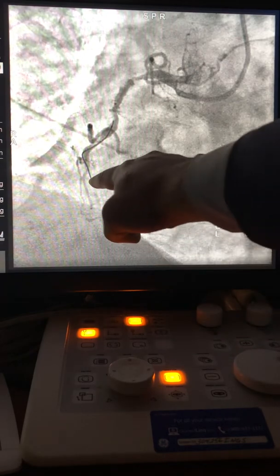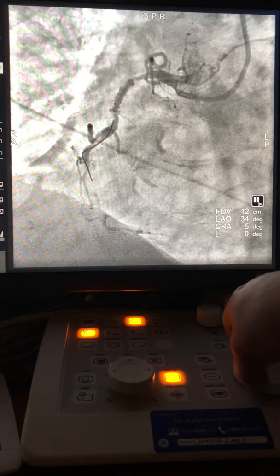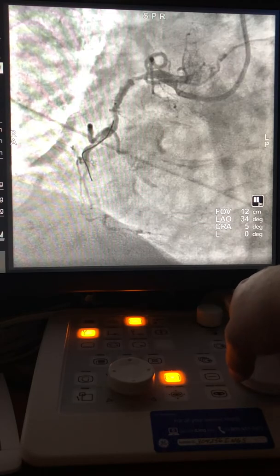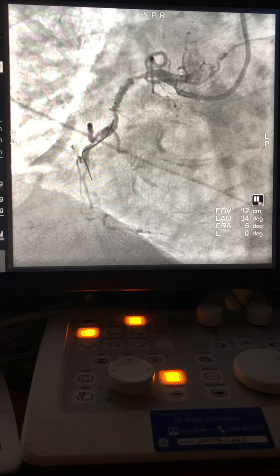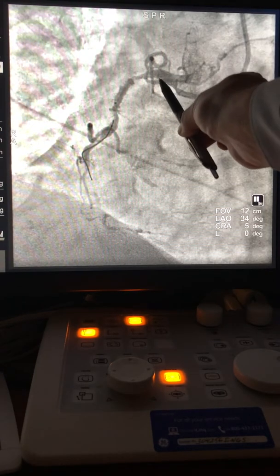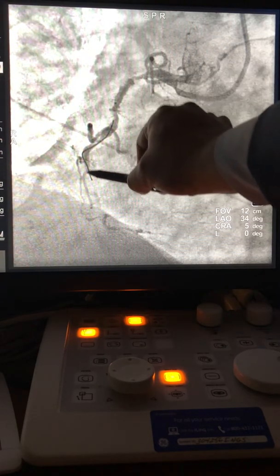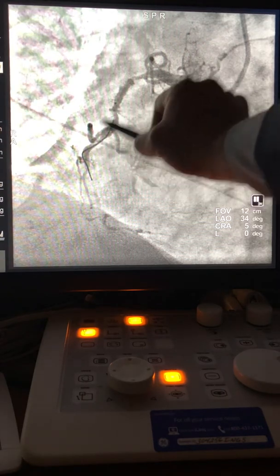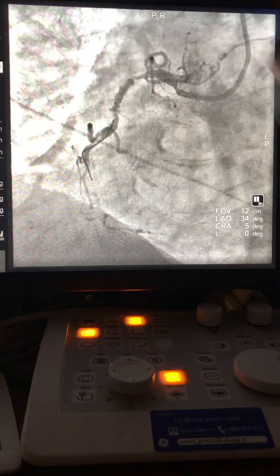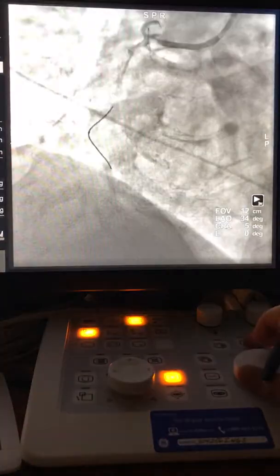You have to be careful here. Once you arrive here, make sure you don't go into a false lumen. I have to take pictures in different projections. You see again there is an area to support the guide. In this case the wire did not pass through because of those blockages, so I have to dilate from here to here at high pressure.